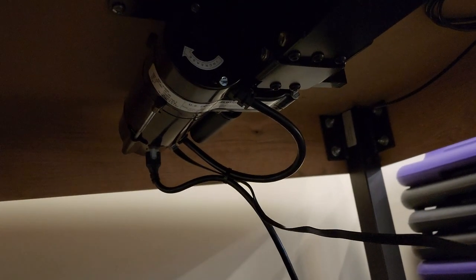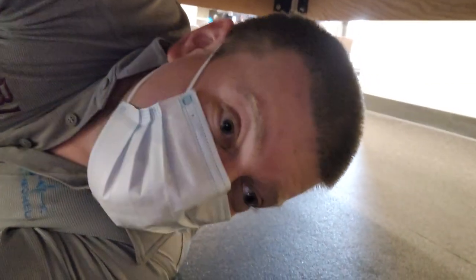That's the most important piece. That's prevention 101. So anyway, guys, everything's going, we're working. Now I'm on to my next work order. Good stuff.